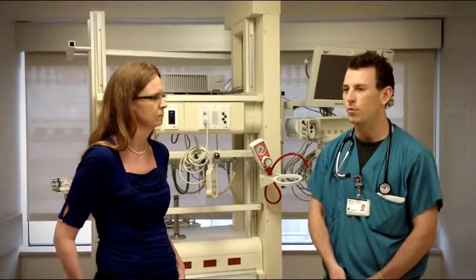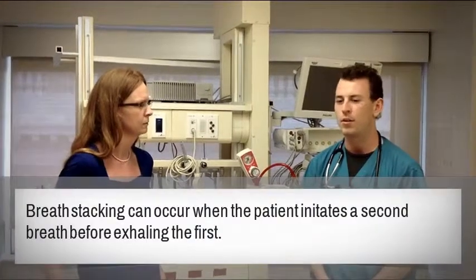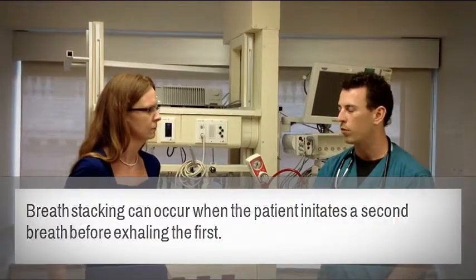Is it uncomfortable? It can be if the patient's awake and the set tidal volume isn't enough, then they will start to set off the alarm on the ventilator. They have what's called breath stacking. Auto-PEEP can ensue if they are uncomfortable, and if they do overbreathe and start double breath stacking, double clutching, it's also called. We can switch them to a mode called pressure support, which is much more comfortable for a patient that's awake. This mode is a spontaneous mode of ventilation. The patient does a lot of the breathing on their own. We use it to wean patients off the ventilator.